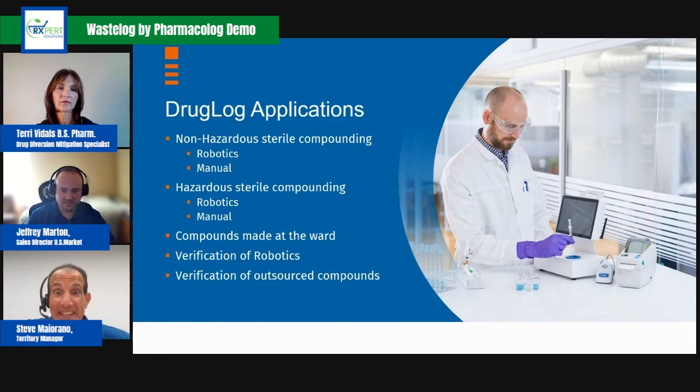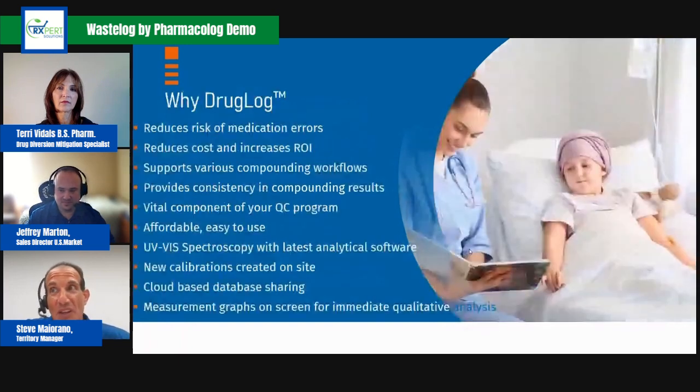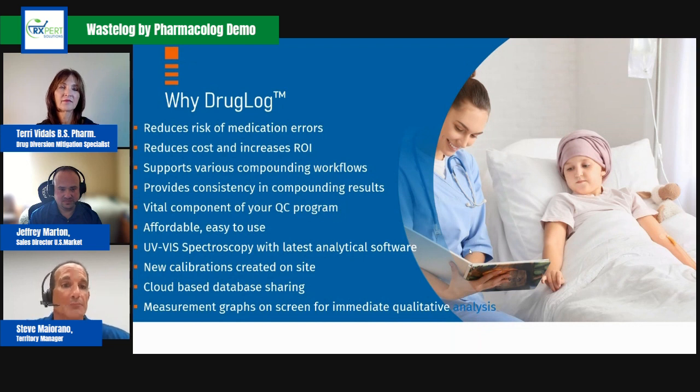Since it's been through FDA, we've been going through some of the reasons why DrugLog would be used. First off, it's part of the quality control process of the medication within the pharmacy at the final check.